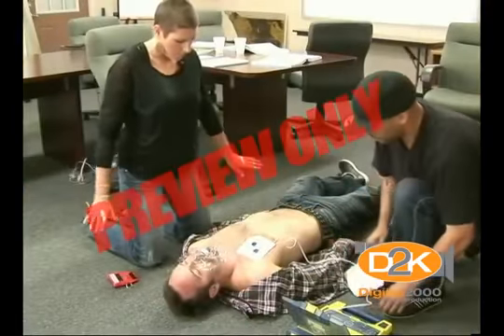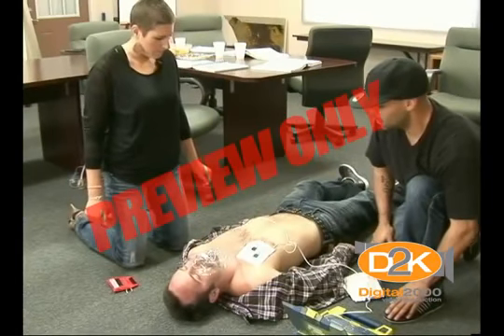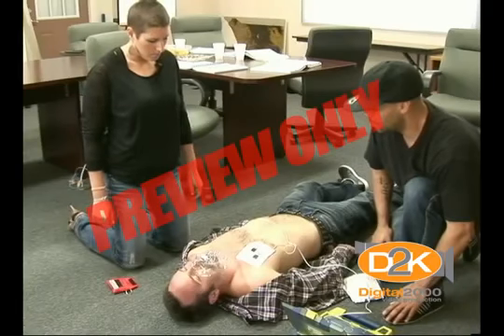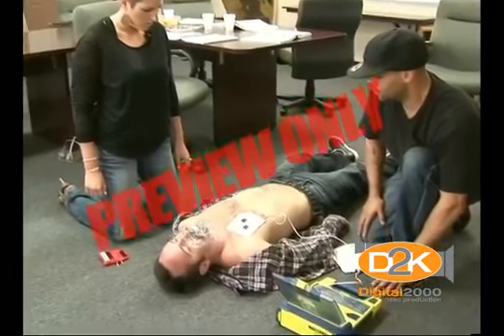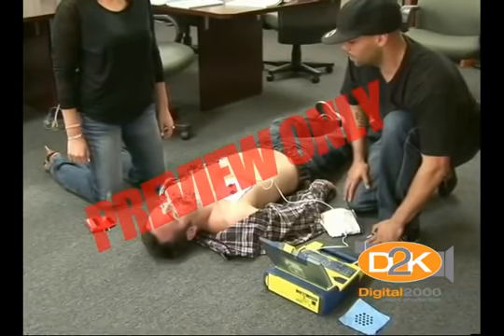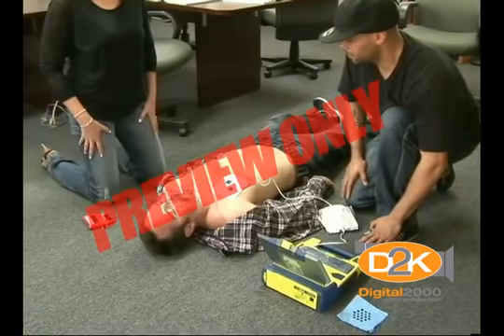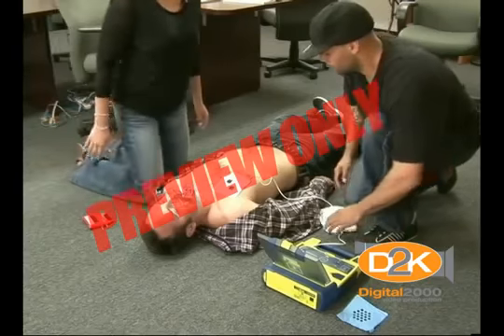Do not touch patient. Everybody clear? I'm clear. Do not touch patient. Analyzing rhythm. Shock advised. Everybody clear? Charging. Stand clear. Shock will be delivered in 3, 2, 1. Shock delivered. It is now safe to touch the patient.